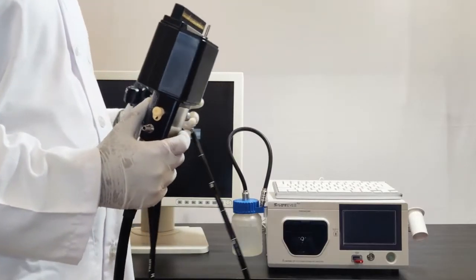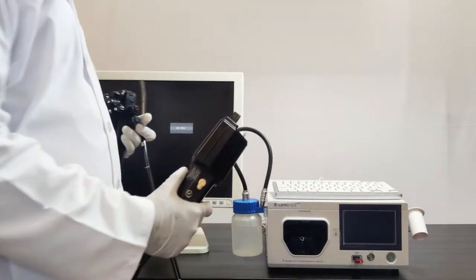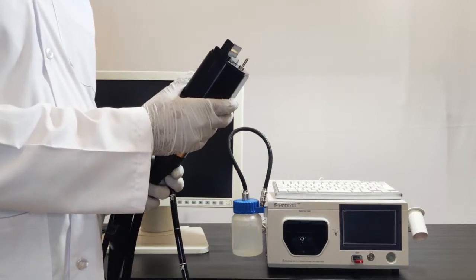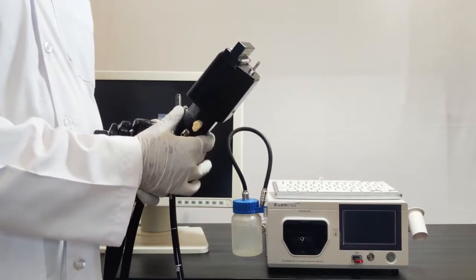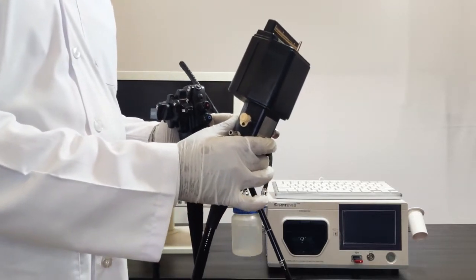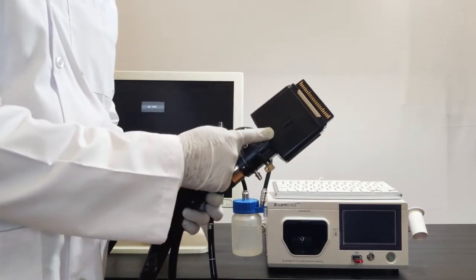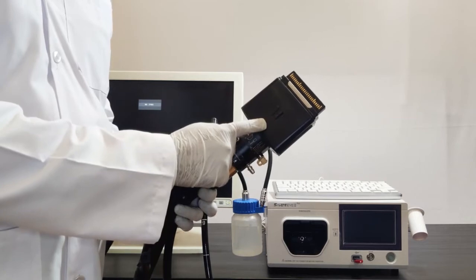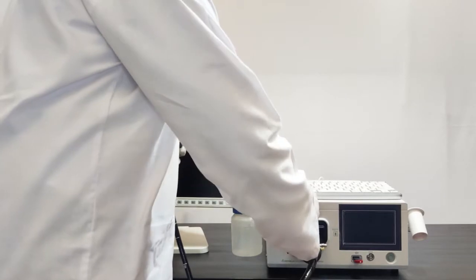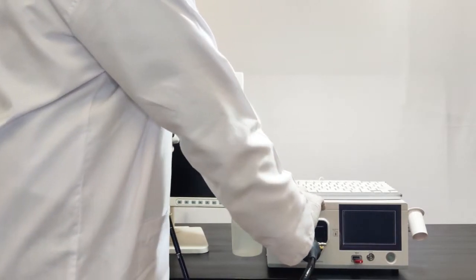Now I am connecting this video gastroscope to the video processor. This is a single-step, ultra-lightweight, waterproof connector — you can completely immerse this scope in water with no requirement for an extra water resistance cap. Here you can see a notch; this is the upper section of the video connector. I am connecting and locking this connector, and you can see it is now completely locked.